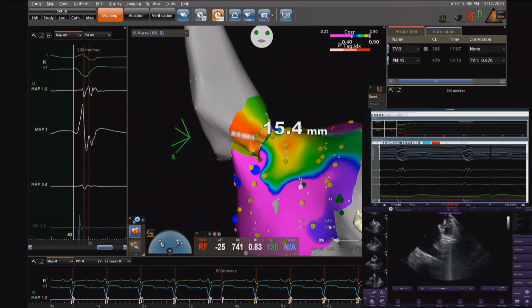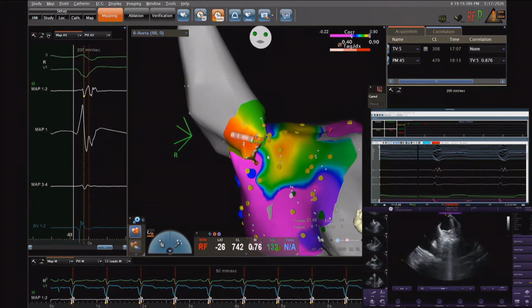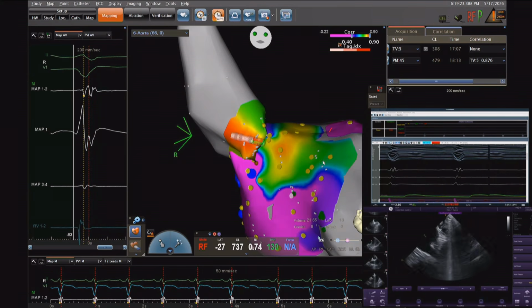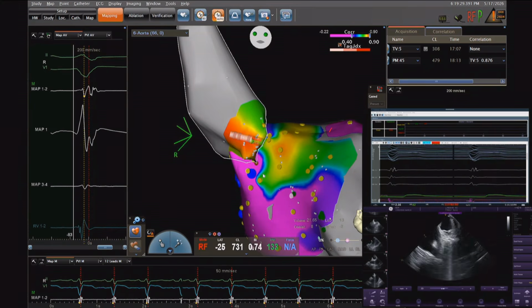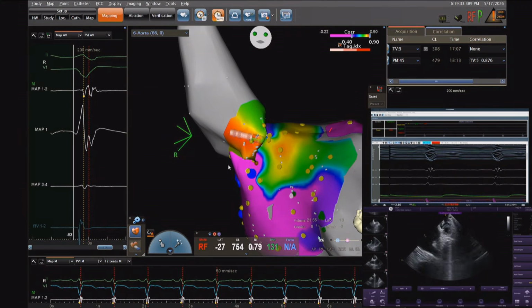And it's faster to go to the anterior part of the left ventricle, because we go from 90 to 84%. So it may be possible that we have some re-entry mechanism going from this site of origin and going in a loop like this. That would be my interpretation here.